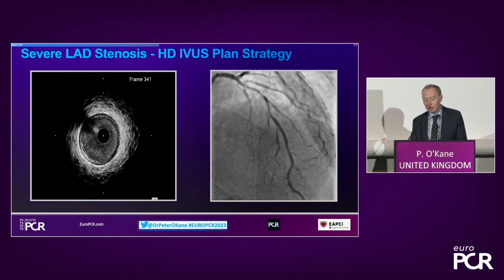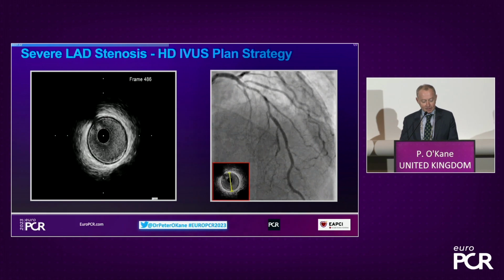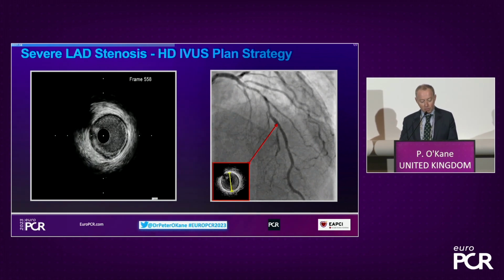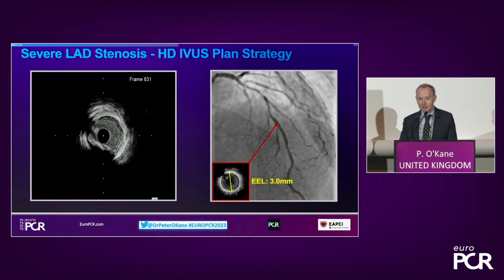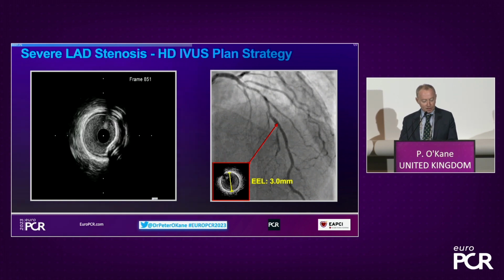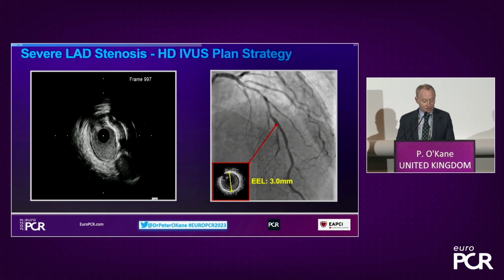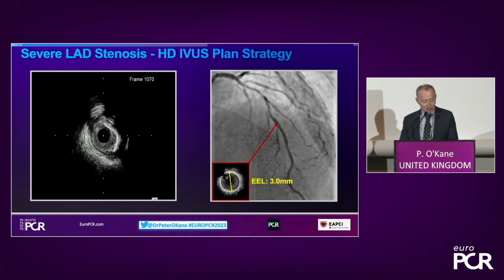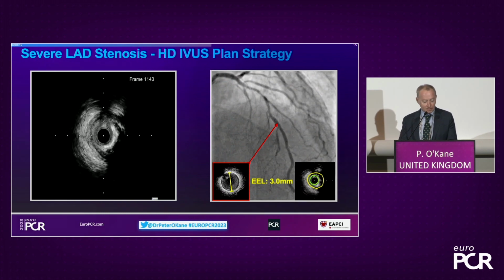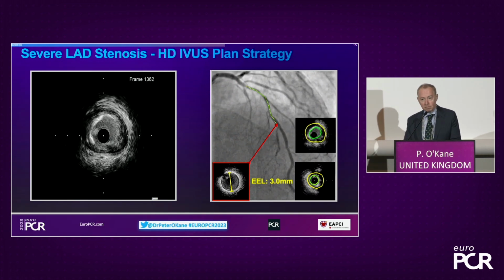I'm a big imaging supporter, and that's what I use routinely, in about 70% of cases. So we're going to do some HD IVUS, and we start with, you can see, a very normal vessel distally, and measure the EEL. It's about 3 millimeters. As we pull back, there's a little drop out with the IVUS, but you can see there's quite extensive plaque over the mid to proximal area. There's some calcification. We can't always tell thickness on IVUS. There isn't a huge amount of reverberation, whether you believe that or not, whether it tells you about thickness. But it's quite severe stenosis, and we can plot that out with IVUS.